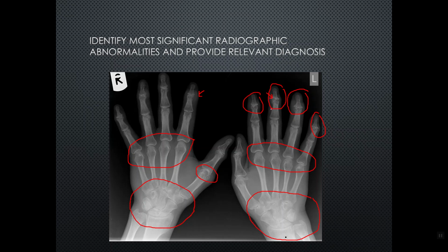And that's basically more characteristic of psoriatic arthritis rather than perhaps rheumatoid. It's based on the target site approach, but also based on the appearance of the pathological changes. So that's what we call radiologic pathologic correlation. We interpret pathological changes by how they demonstrate on imaging. So that's basically a learning case of psoriatic arthritis that differs from rheumatoid in its presentation.